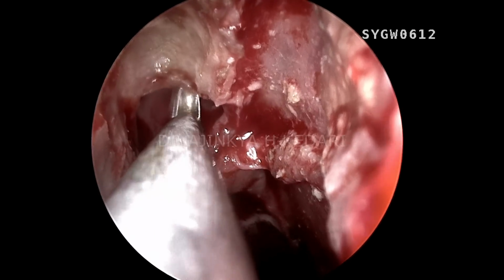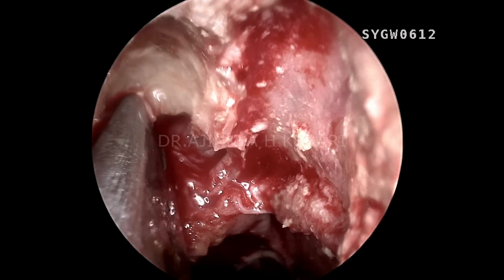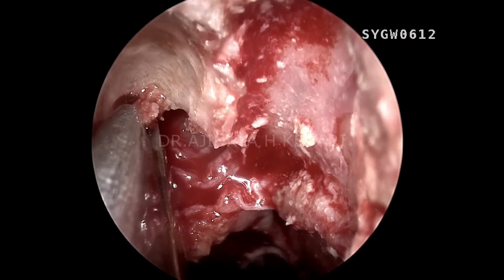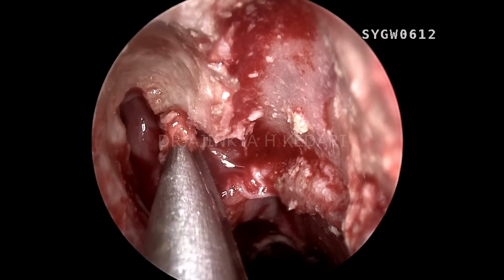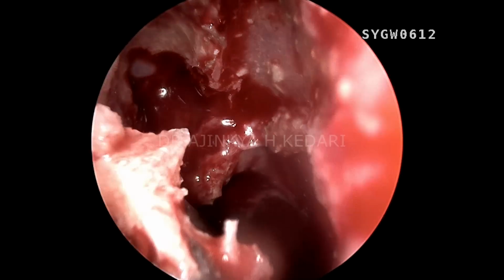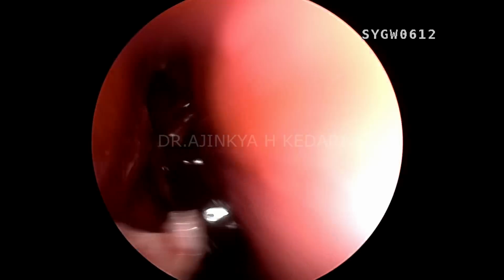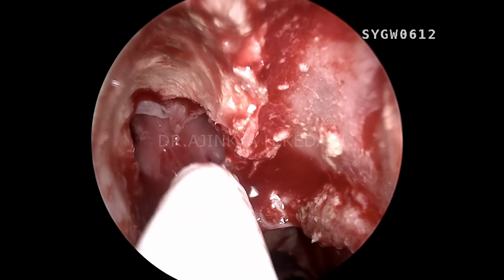So what you can do, you can also use an upturned bone punch. You can either use a straight punch or an upturned bone punch, and you can punch it out. So you can see the punching is much easier. If you have an angled burr, the 15-degree angled shaft, you can use that to drill very easily. If you don't have that, you can definitely use this bone punch, the curved bone punch. As you can see, I'm able to punch out a lot of bone in a very short amount of time as compared to drilling.